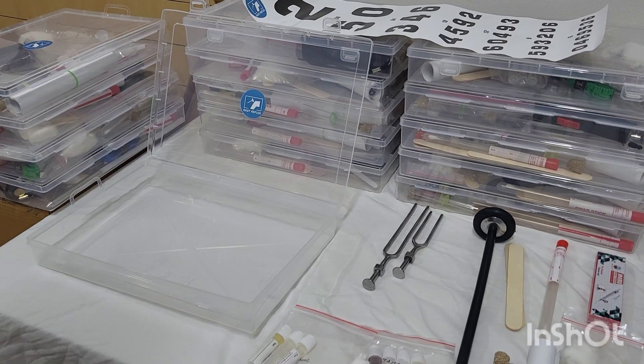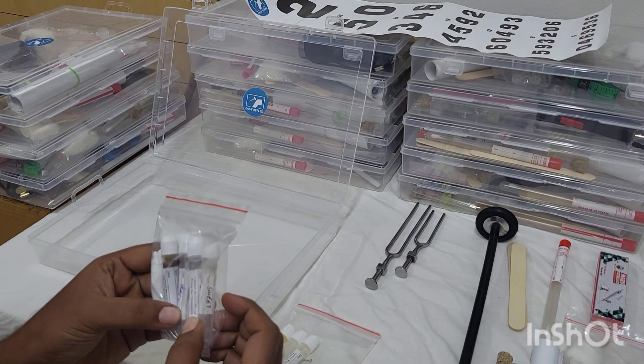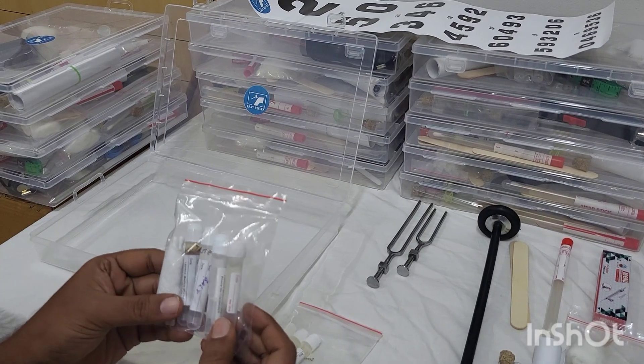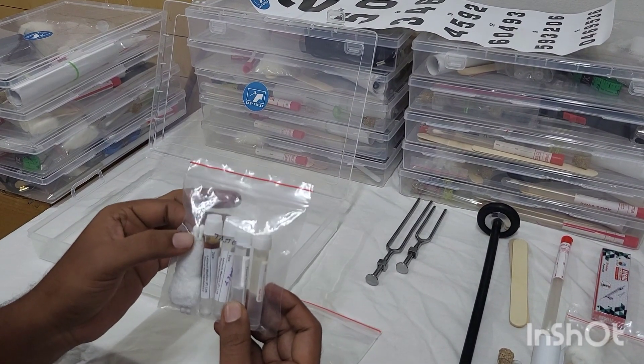Similarly, we have also formulated a synthetic taste pack which contains sweet, sour, salt, and bitter. They are also synthetic. We have given tongue-holding gauze as well as buds for you to apply in the particular portions of the tongue.